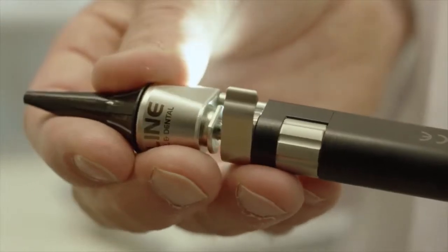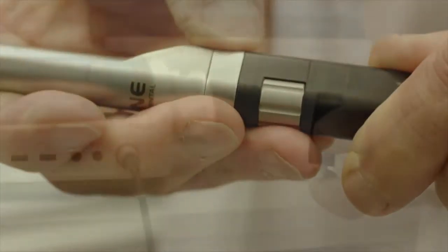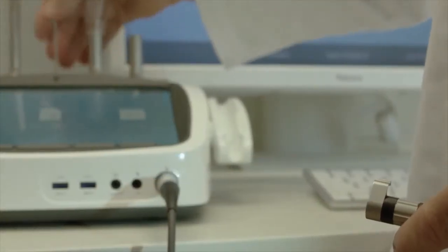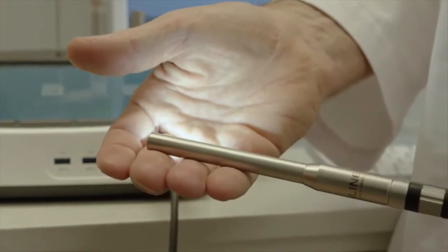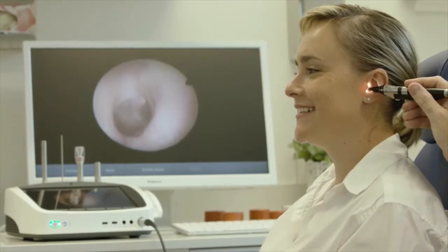Using an ergonomically designed coupling mechanism, each of the interchangeable probes can be fitted to the handpiece to facilitate a user-friendly interface for the patient examination. The Pro-EX has a high intensity LED light source integrated into the handpiece and automatically records high resolution still and video images against the patient file in the local database.